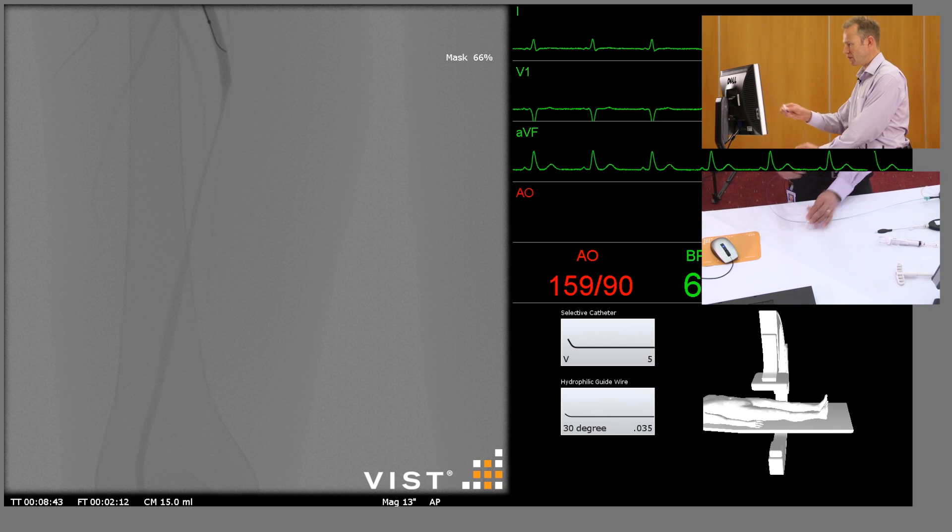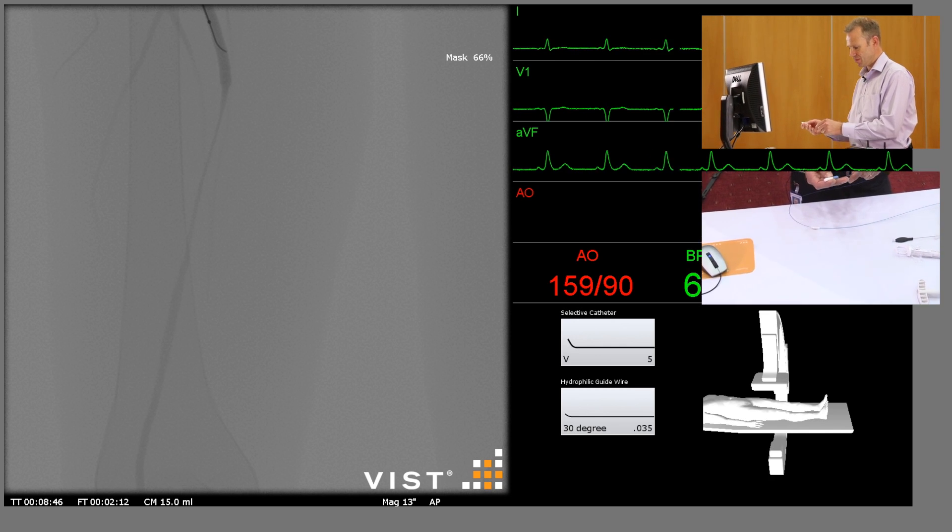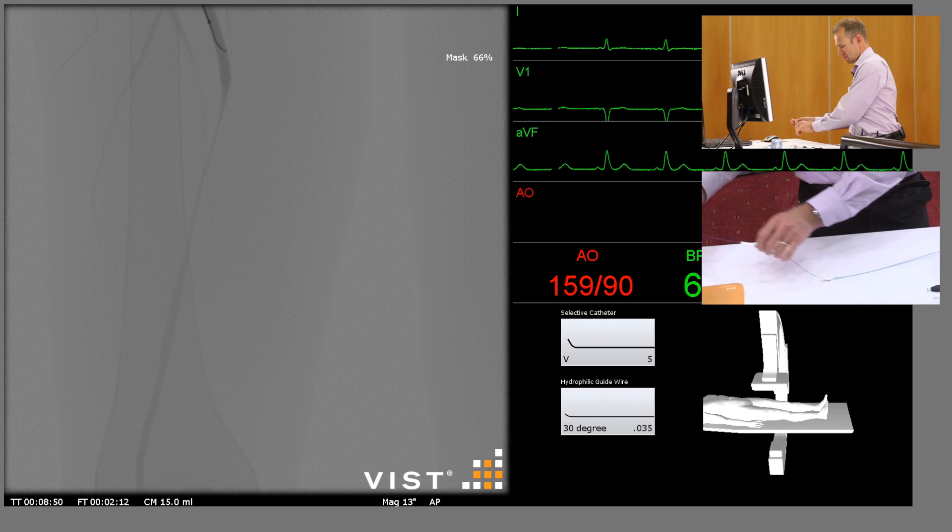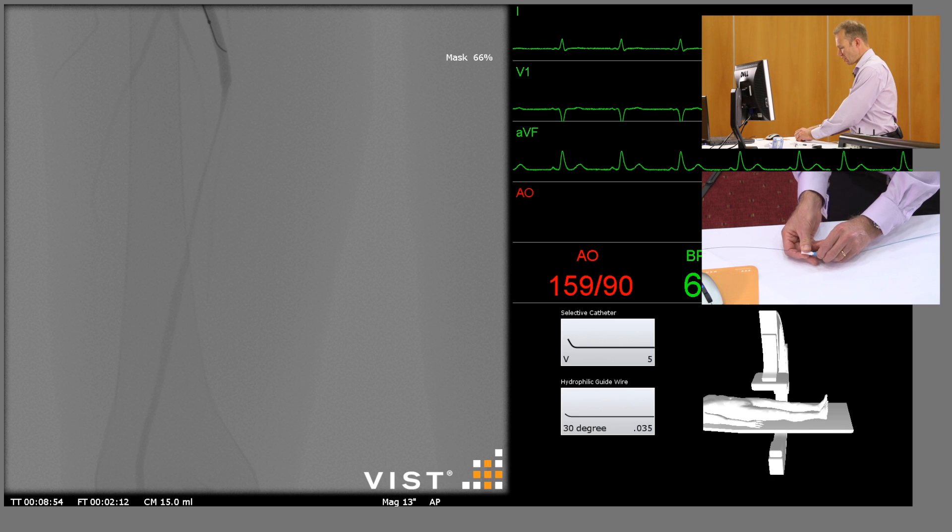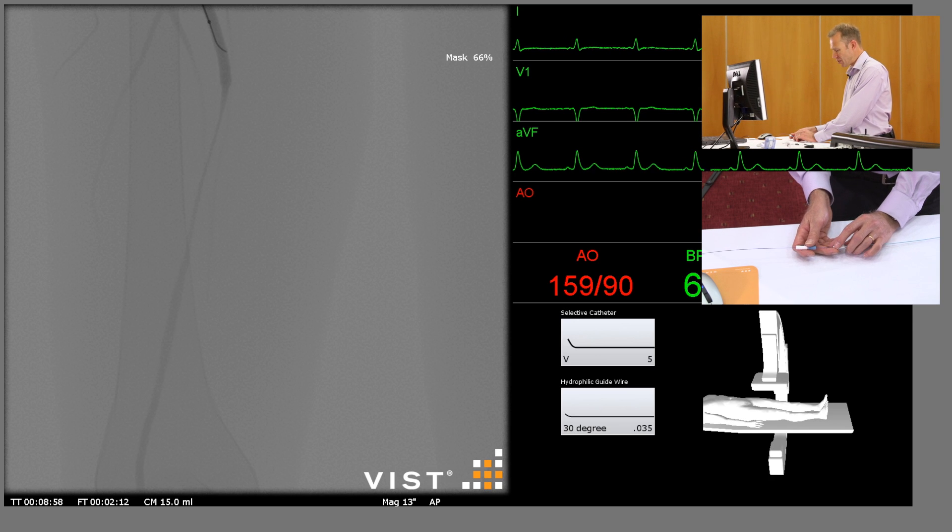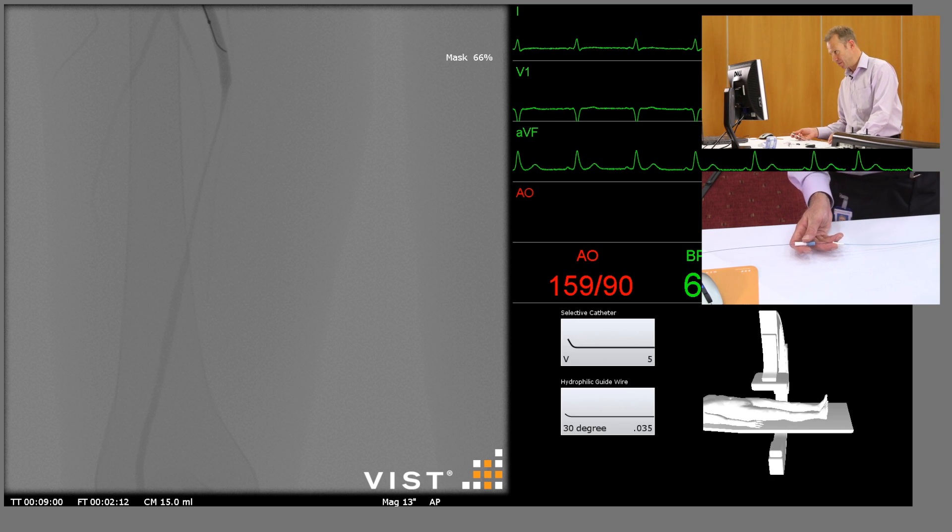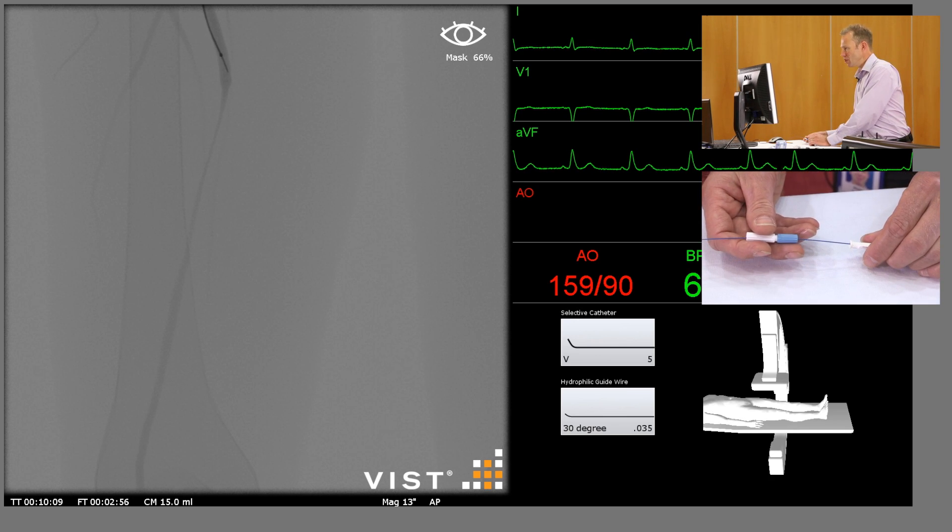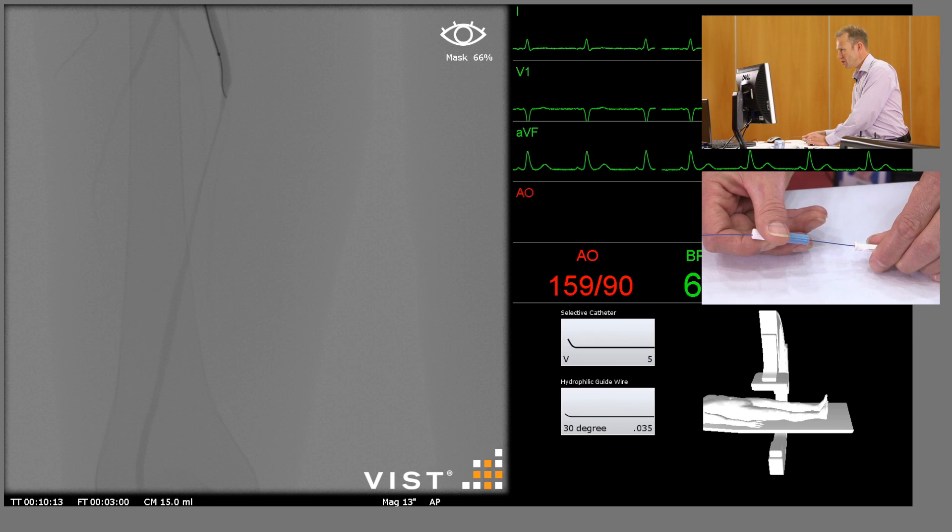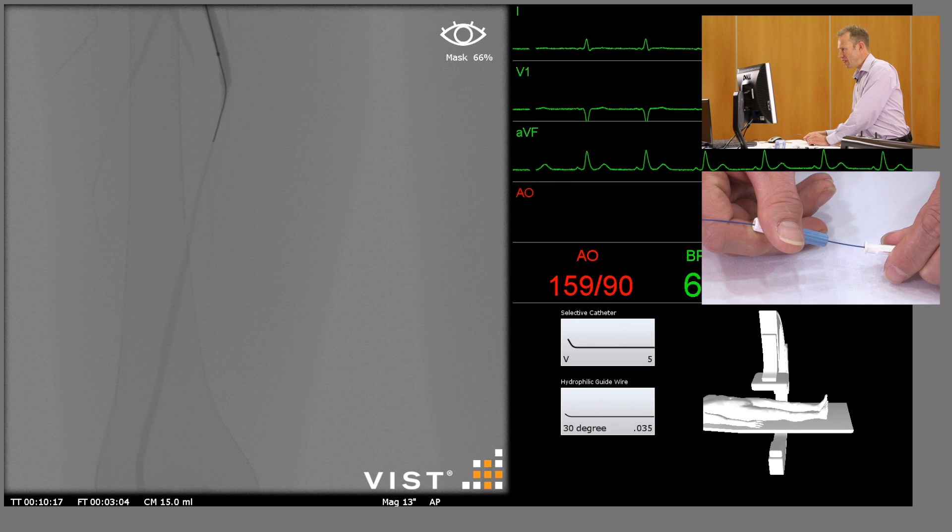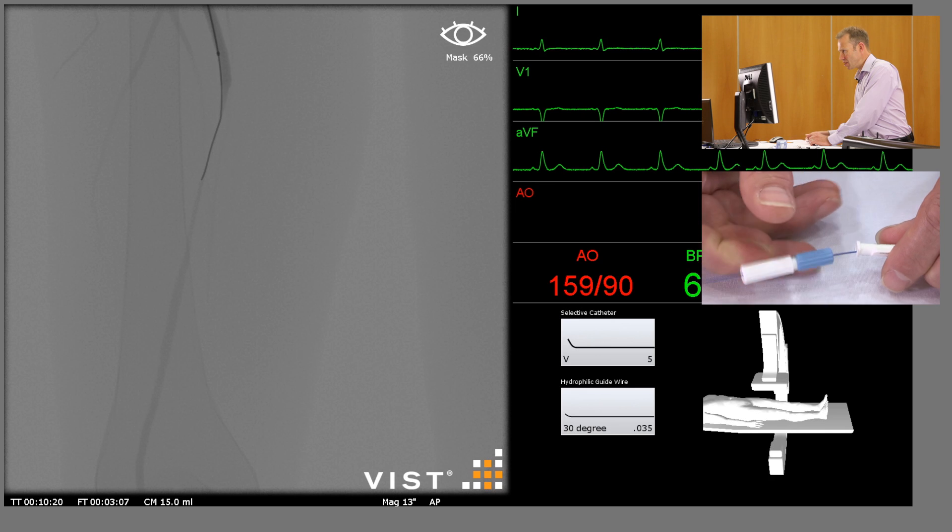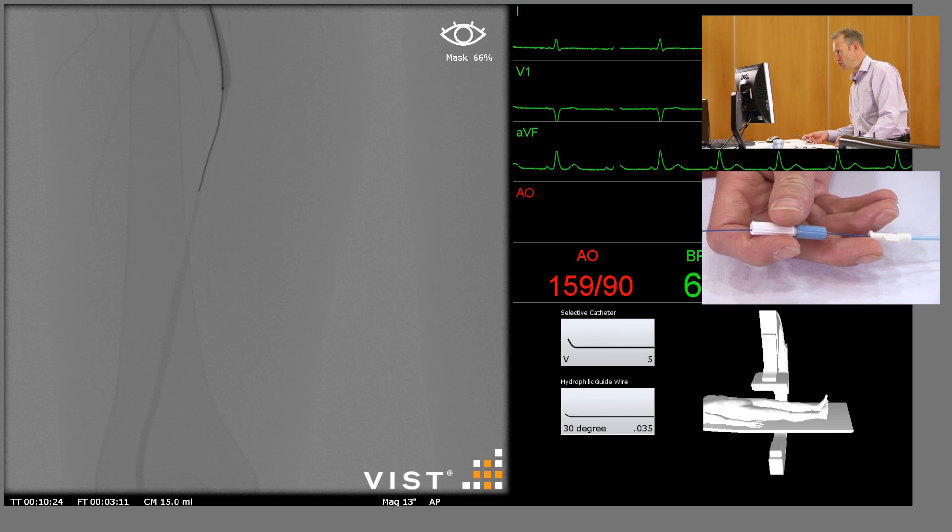We're just going to attach the torque device to our guide wire. I'm going to keep the torque device relatively close to the proximal end of the catheter so I can control both together. We have our guide wire out of the end of the catheter and I'm going to use the torque device and just manipulate it down through the stenosis through the middle of the lumen. If I were to catch on any plaque on the way down here I could end up doing a sub-intimal angioplasty, but for the purpose of this procedure we're going to try and stay intraluminal.